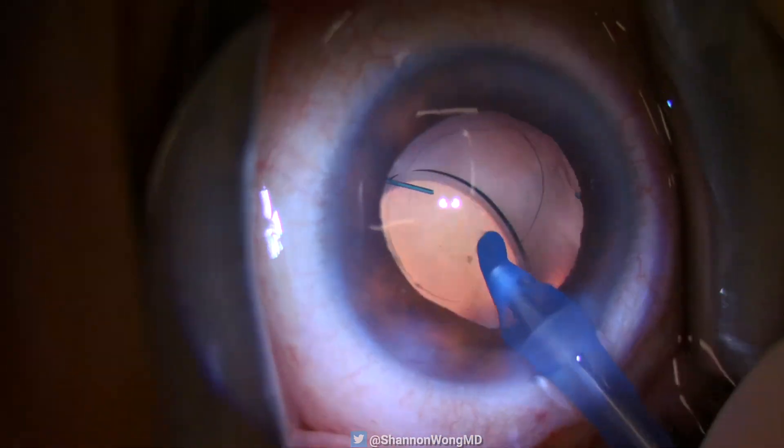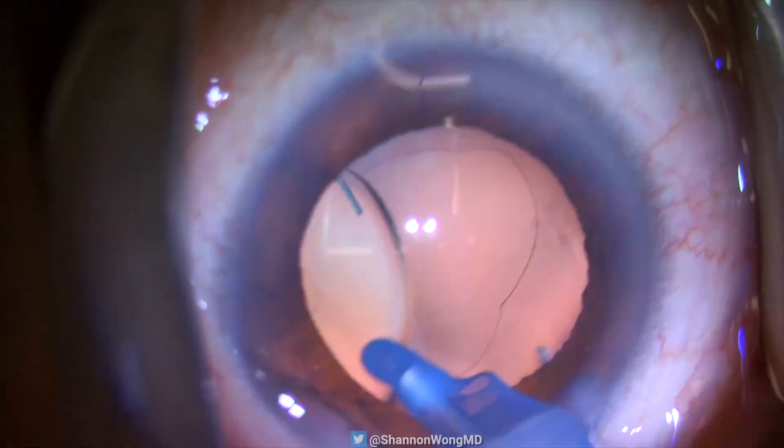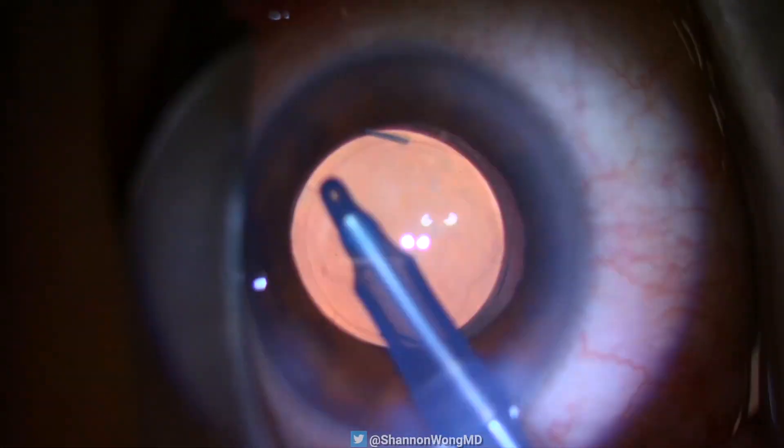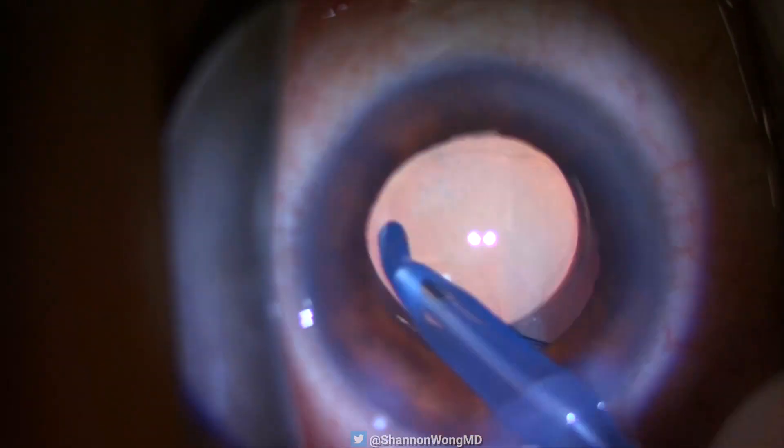I have performed this maneuver hundreds of times over the past decade and have not noticed any long-term issues with these patients. The lens seems to stay very well-centered long-term.